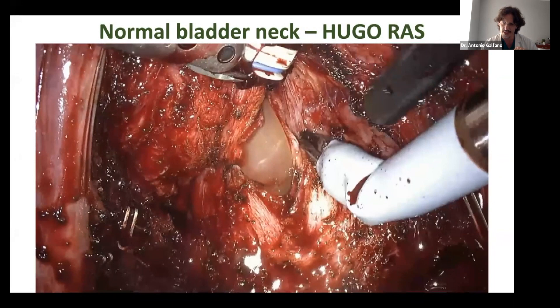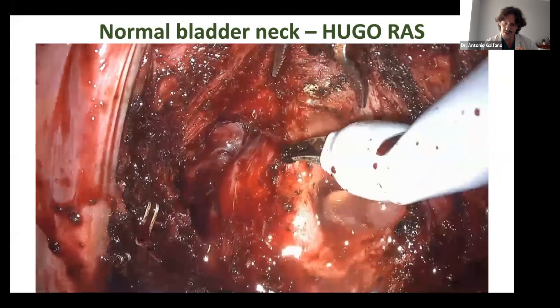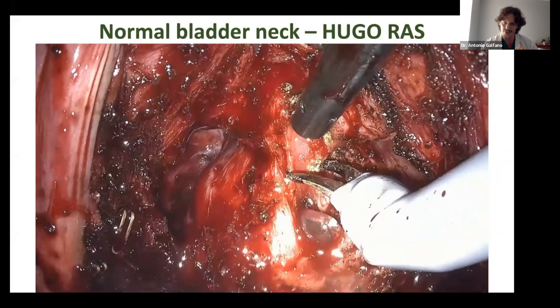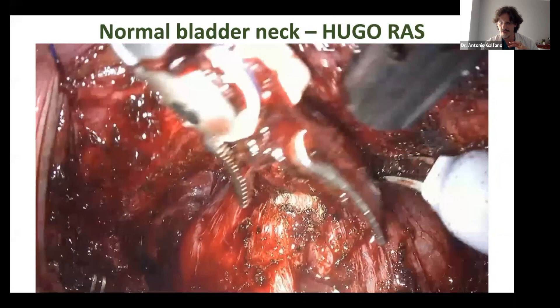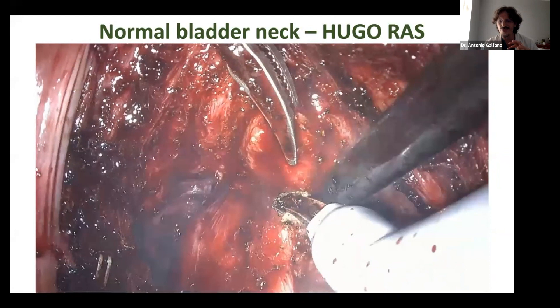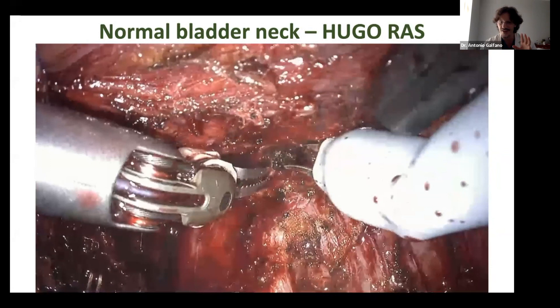This is the place where we have to choose to spare or not the DVC. Traction is really important in these situations. I understand it's difficult to tell if this is a Da Vinci or Medtronic view — from the surgical point of view, it's exactly the same.